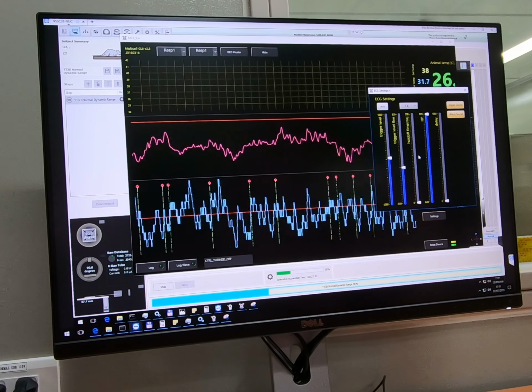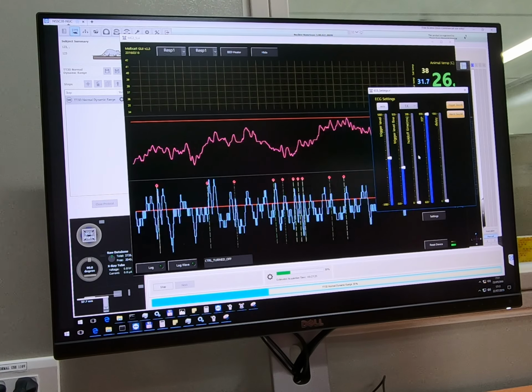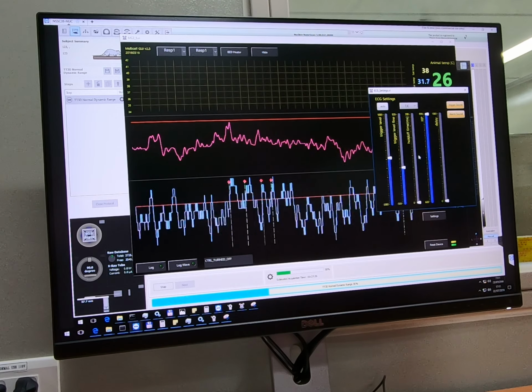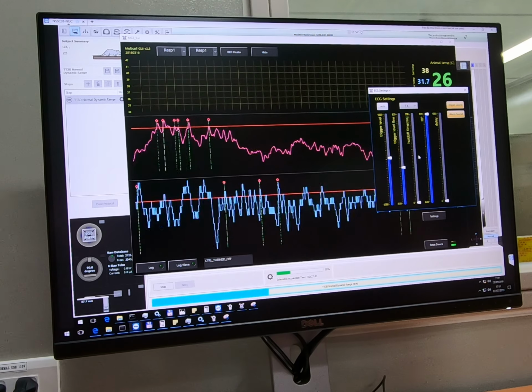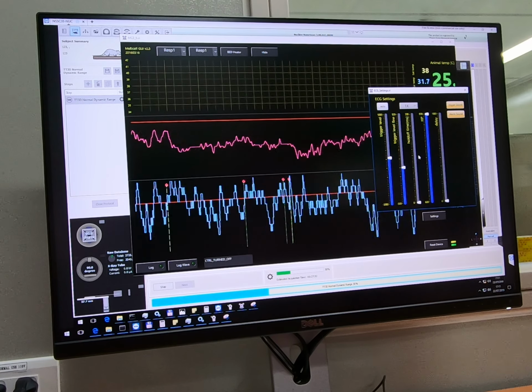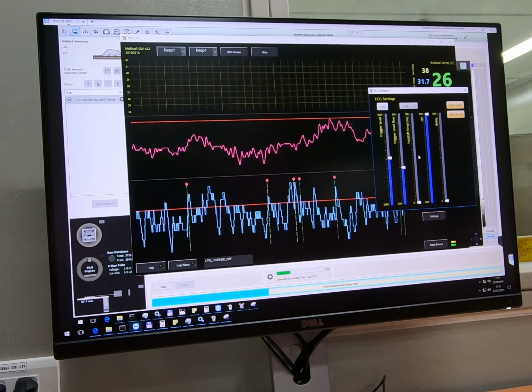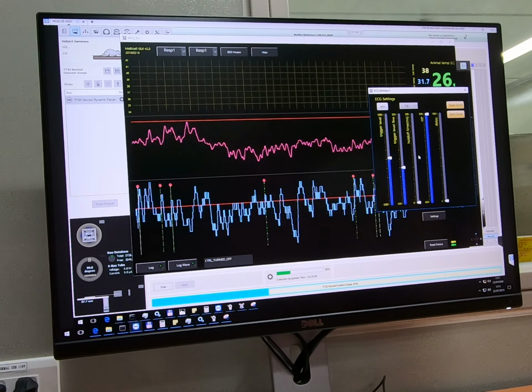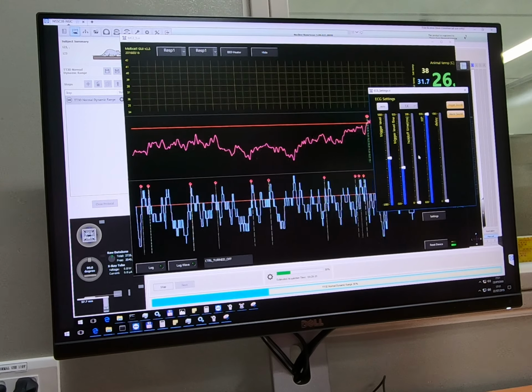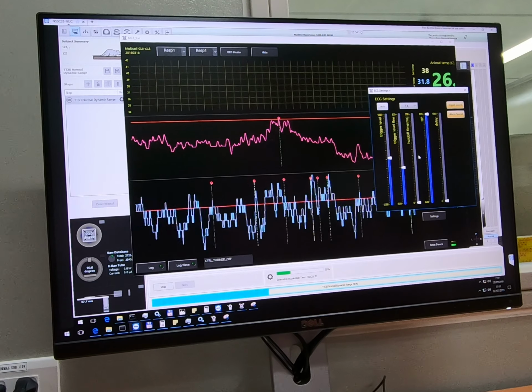So it's useful if you have, for some reason, a noisy signal, and you see that not all the peaks belong to a real heartbeat. Sometimes the respiration is also affected by the anesthesia, and it can create extra peaks which can also be converted to that curve, and you might need to exclude them from the scan.